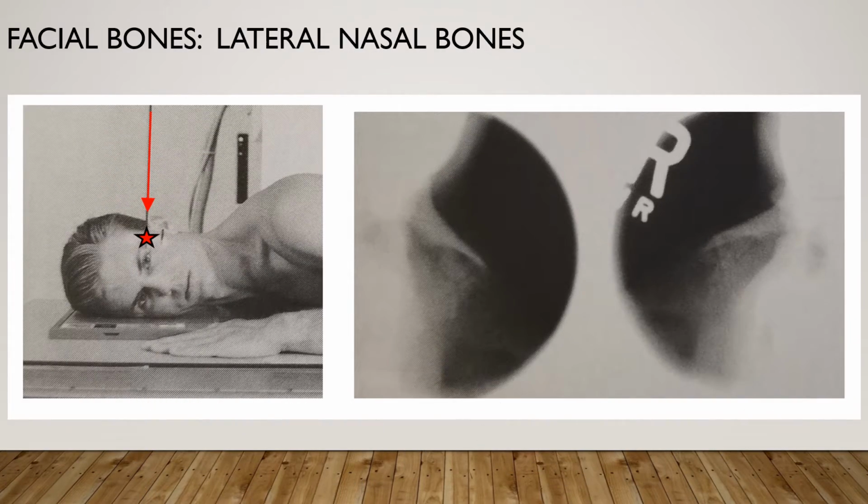Now, if a patient is coming in for a nasal bone X-ray, typically what you will do is take the last X-ray, which was the 37-degree Waters, and then you're going to take pictures of just the nasal bones. You would want to perform a right and a left lateral. The reason you want to perform the right and the left lateral is because we have two nasal bones side by side, and it's very important that the patient is 100% lateral for these images so that you can see if there's a fracture on each particular side, the right nasal versus the left nasal.